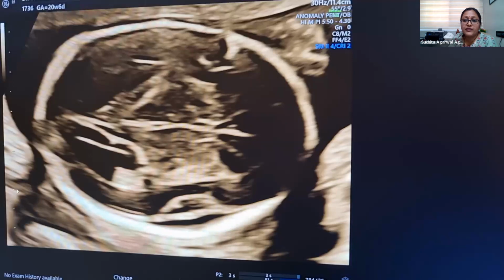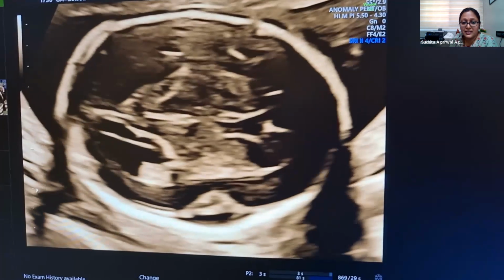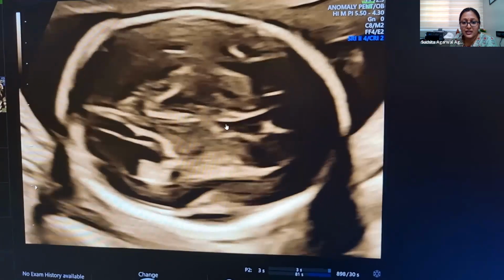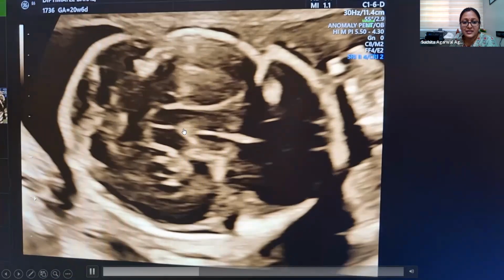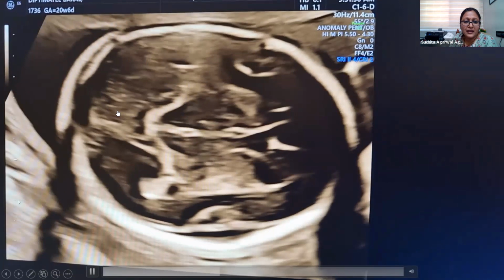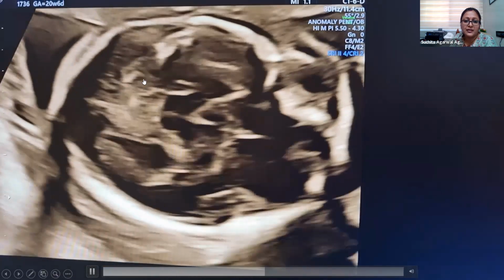So this is one video which shows 3 planes in one go. Here we get the transventricular plane. This is the transthalamic plane, and here now we get the transcerebellar plane.